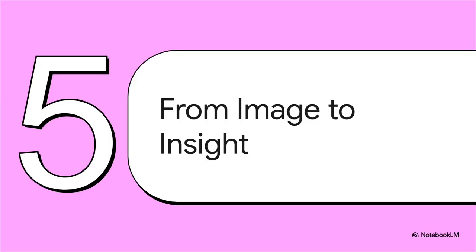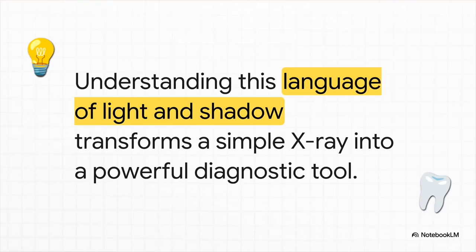So we've covered the language, the tools, and the landmarks. But why does any of this actually matter? What's the takeaway? It's because when you can speak this language, an X-ray is no longer just a picture. It transforms into a rich, detailed story.